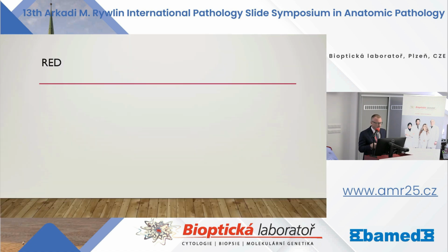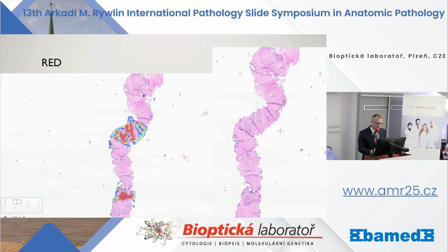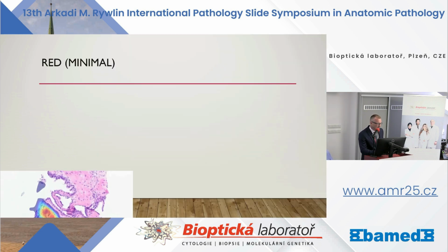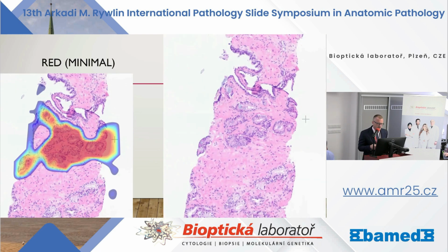And then when you get the red one, you get straightforward carcinoma, like here or here. And again, you can get some minimal foci, like this, a straightforward 3+3, which looks like that. You wouldn't miss it anyhow, or you shouldn't.